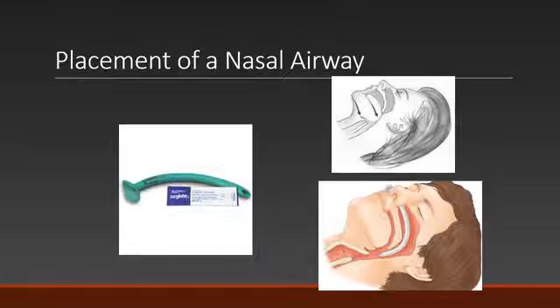With a nasal airway, it's a very similar concept. You can see the nasal airway. This is a different kind of design.